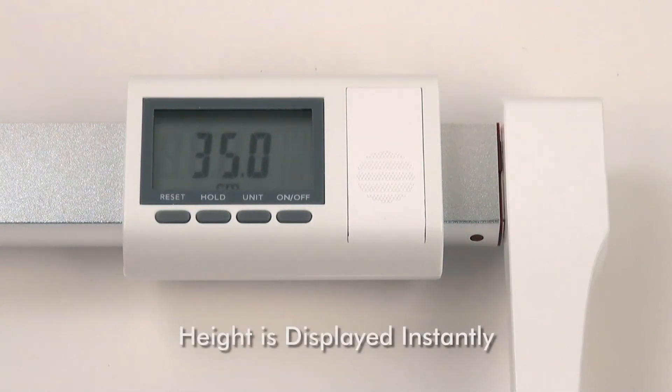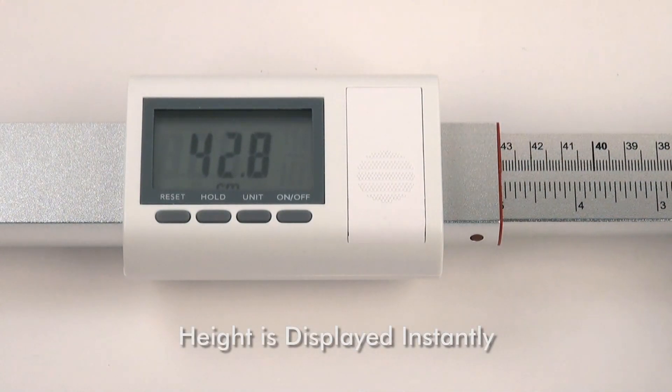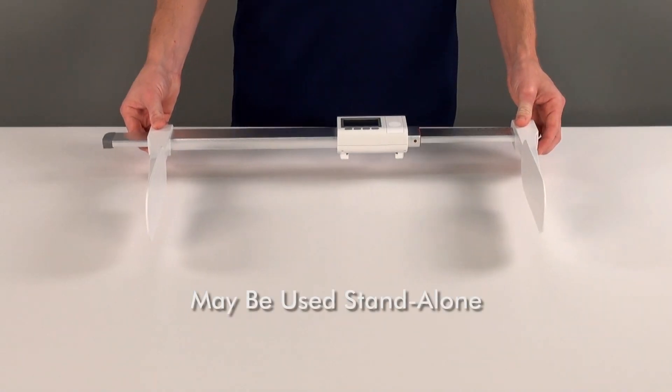The height of the infant is displayed instantly on the bold LCD located on the height rod. The LCD features a convenient unit switching button to display measurements in three different variations.